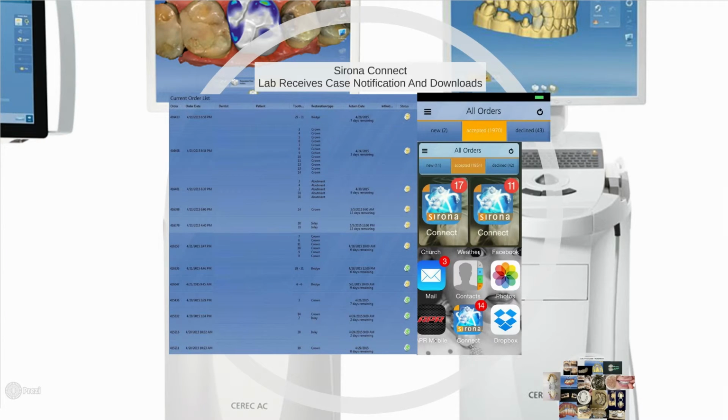Also on both devices, we're able to review the impression and make sure that all information to provide the best restoration possible is provided. If any information is missing, we're able to call the office immediately to get the information that is needed before the patient has a chance to leave the office. We find that this is very helpful when communicating with the offices, and it saves the office, the patient, and the laboratory a lot of time and headache later on down the road.